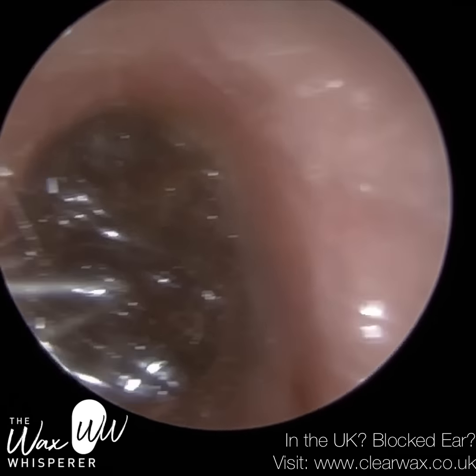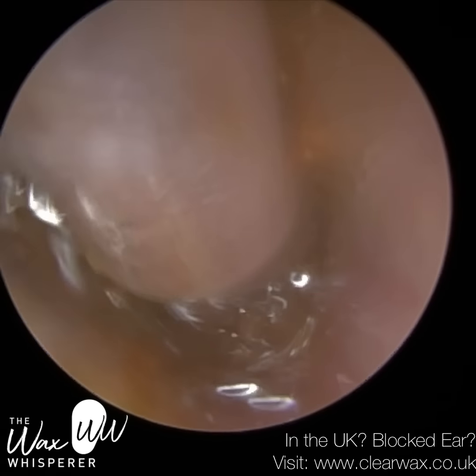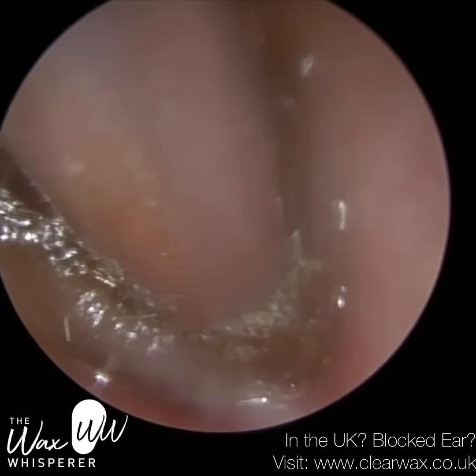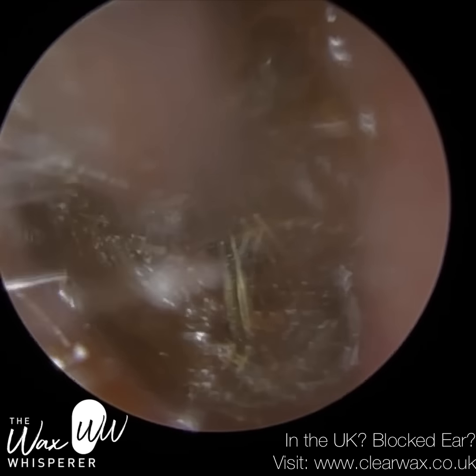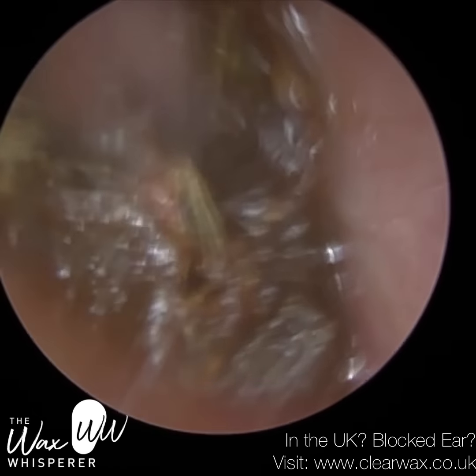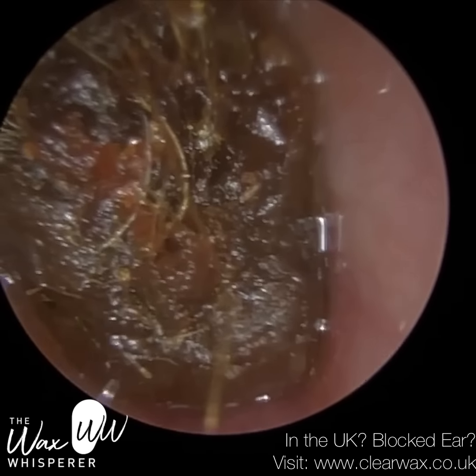I think we just put a bit more sodium bicarbonate drops in, just to loosen it and lubricate the canal wall. And I'm going to try to release it from the bottom, so I'm going to hover this upwards. I'm just going to rotate the wax whilst it's in the ear, or should I say skin plug. There's a few hairs at the entrance, so they've got a bit wet because of the drop, so it's almost smearing against the lens of the endoscope. I'm just going to go a bit further in with the endoscope, trying to get through those hairs if I can.